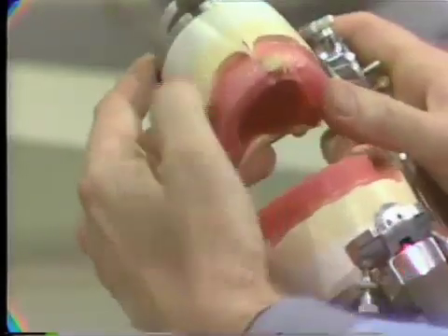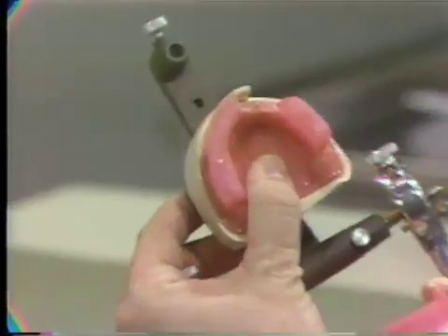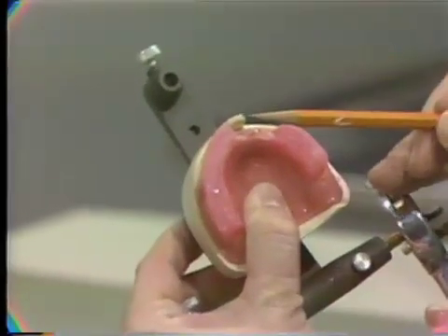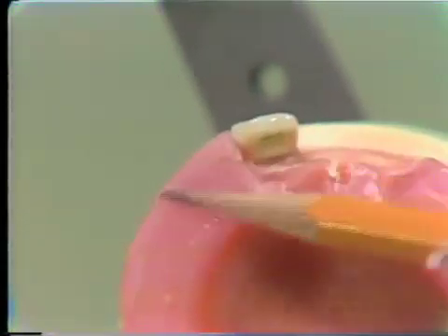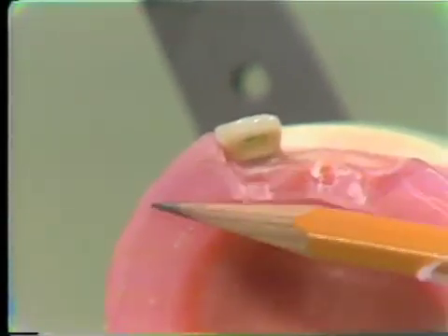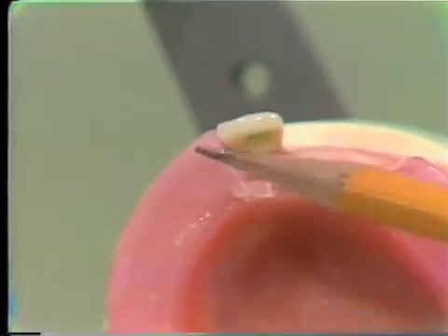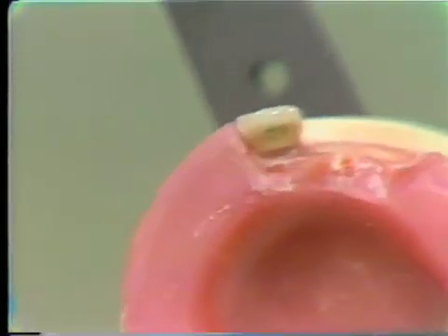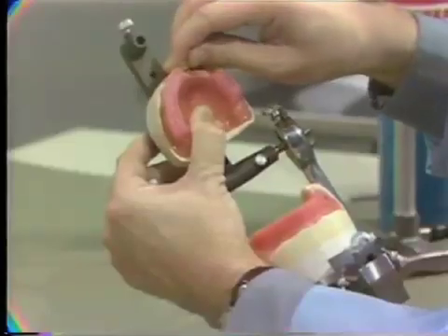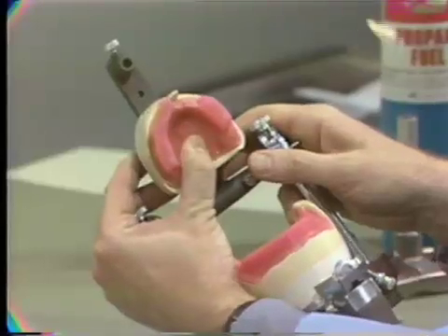And then the third thing to look for is we open the articulator and look directly down. We want the incisal edge of this tooth to follow the contour of the wax rim on the other side. You remember, this was developed theoretically, and it will be in the clinic, it was developed in the mouth. So we have the contour, and we want to use that as a guide. So if your tooth is set like this, which is very easy to do, we have a correction to make. We follow the contour.